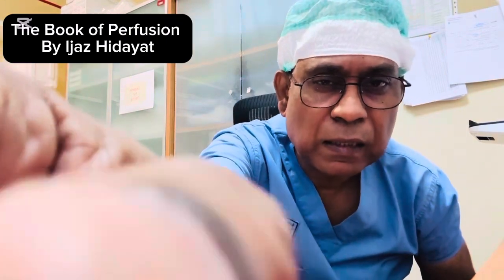At the time of the ECPR, this is like a panic situation where everyone is trying to save the patient's life. So in these situations, there should be one team leader, and the roles are divided by the team leader. Perfusionists have their own role to take care of the console, cannulas, guide wires.